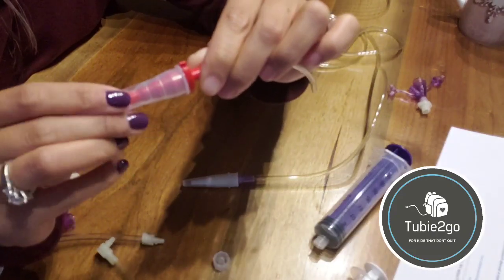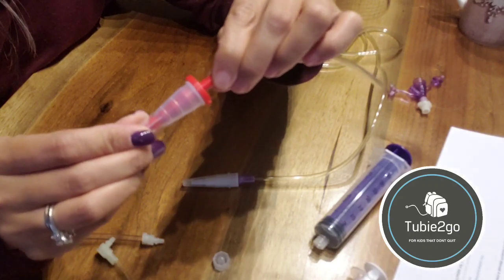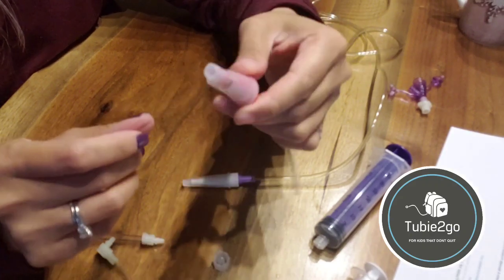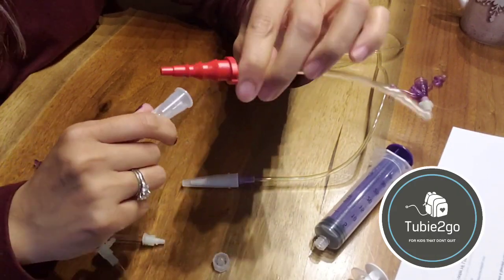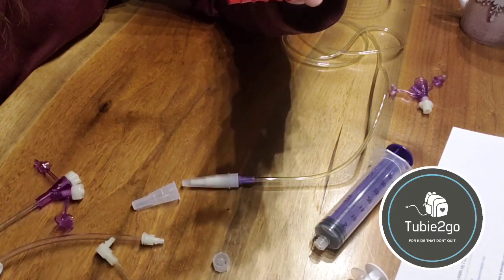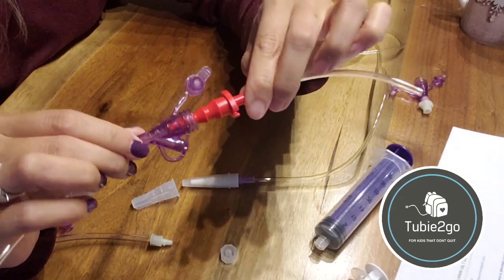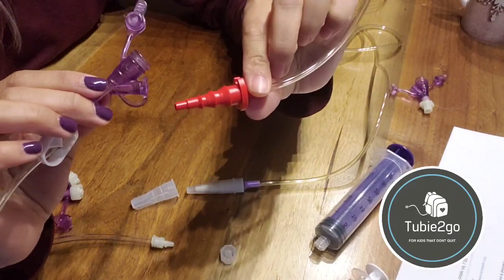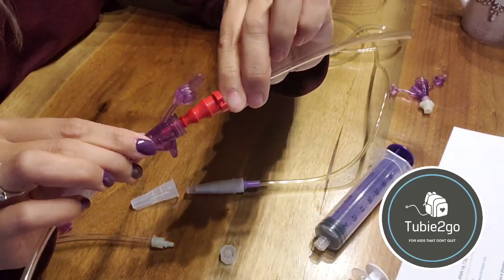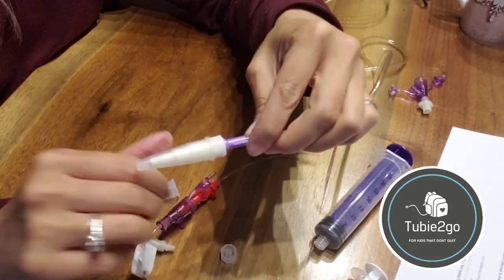If you still have these, you might want to check the expiration date on these, as they might be coming up due, or they may already be expired because this is an older style. Although this is what I've been told, this red style tip does stay into the typical extension set port better than the new white Christmas trees. But again, they're being phased out, so probably won't see this style around much longer. Everything is switching over to the white tips, which are ENFit compatible.